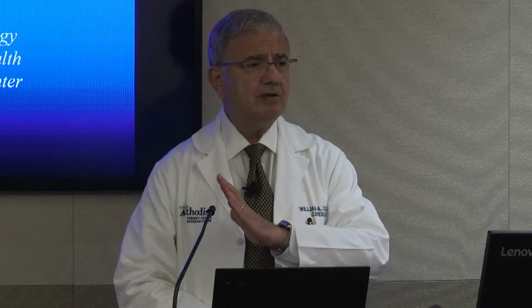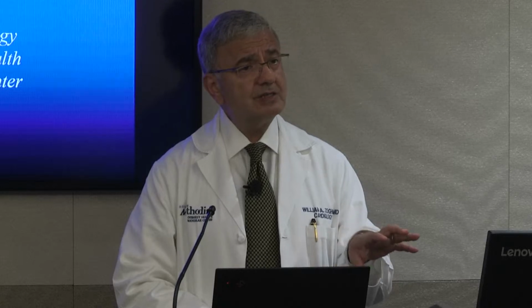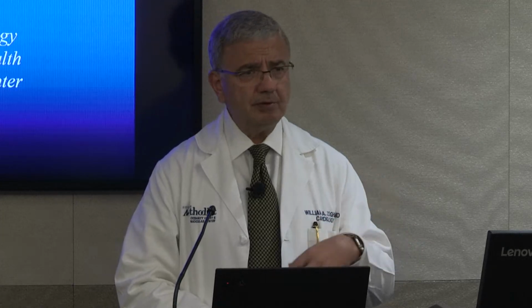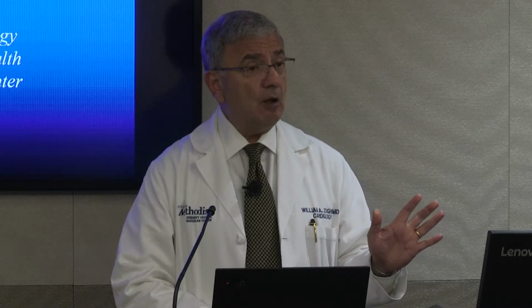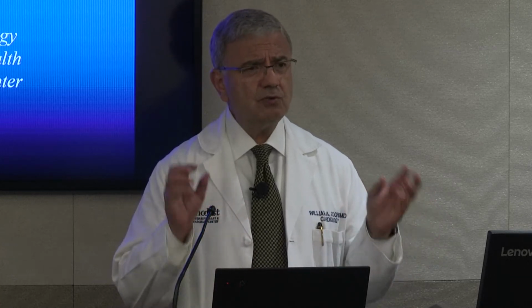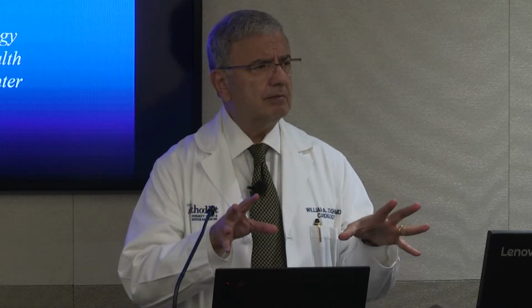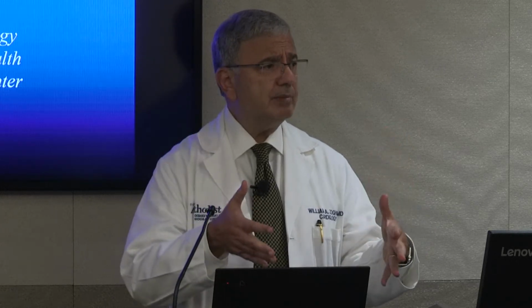If you want to remember 2 things: the field has evolved because of technology, but the imaging is still the same. If I want to know what the image is like, that's one question of how deep it is in the chest, or, if you're a fisherman, how deep it is, where the fish are present. The other is that Doppler is asking a different question. So these are the two questions. One, I send ultrasound waves, they reflect back, and I know how deep they are, and I know their structure.